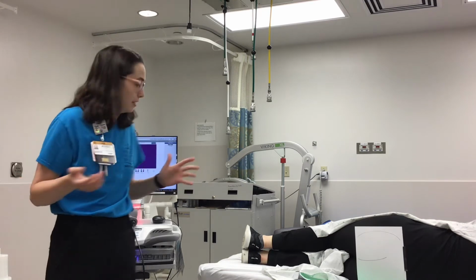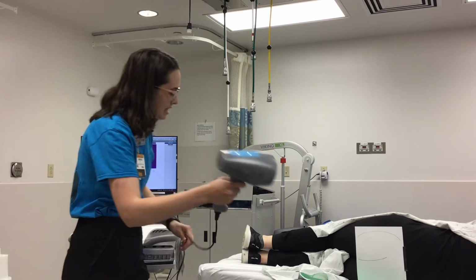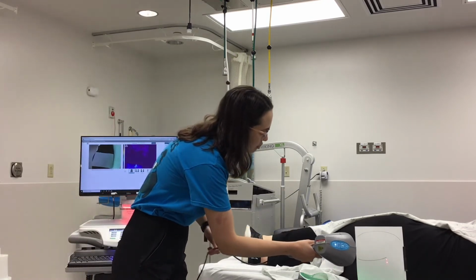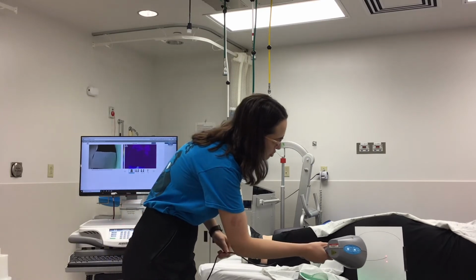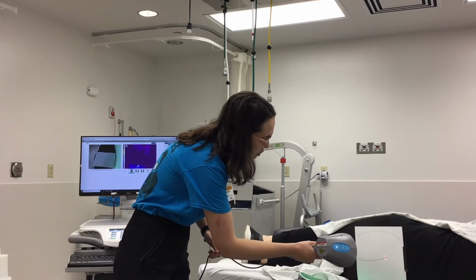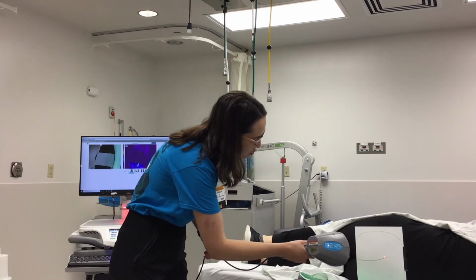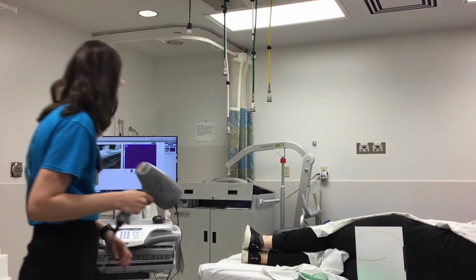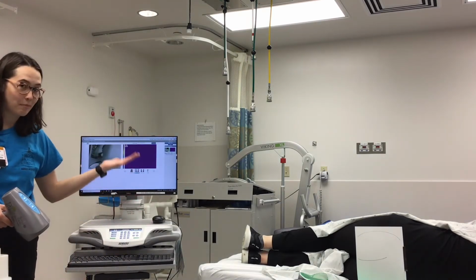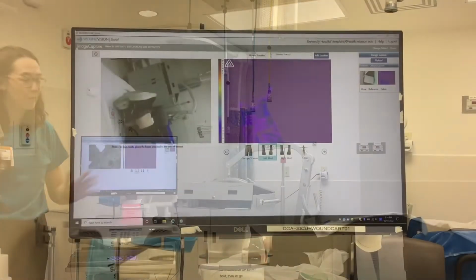So, here goes nothing. You're going to grab your handy-dandy scanner, hold it 90 degrees perpendicular to the patient, and press down the trigger halfway until you see 2 small dots appear. Only push it down halfway, and then you're going to move until the two dots become 1. Then you'll push your whole trigger down and let go. You should have a scan that pops up on your Wound Scout. After that, it's rinse and repeat.